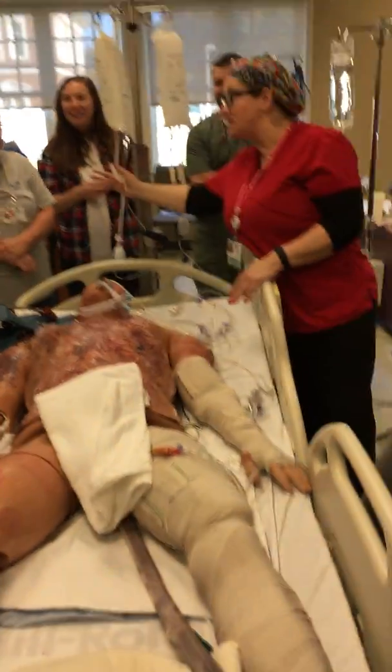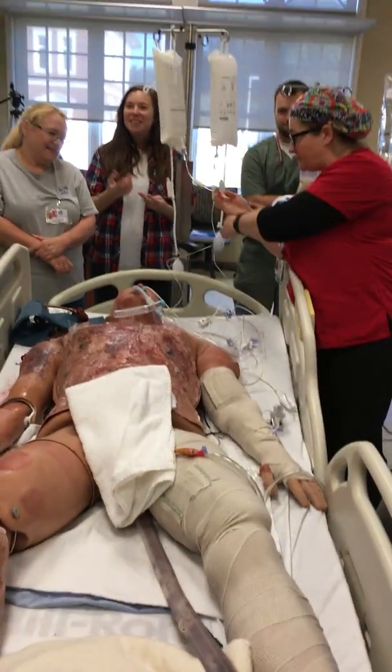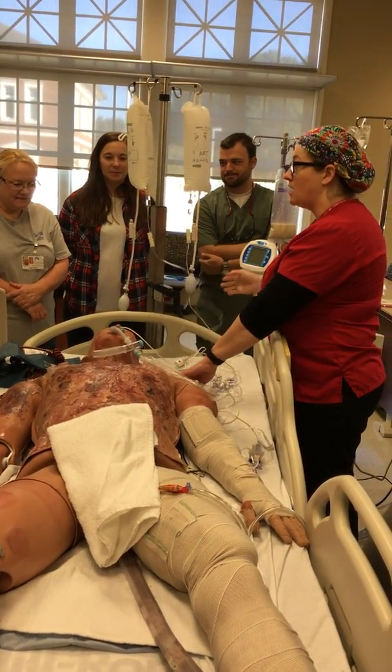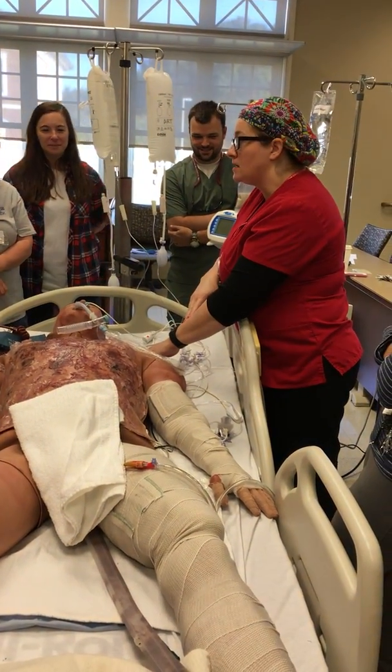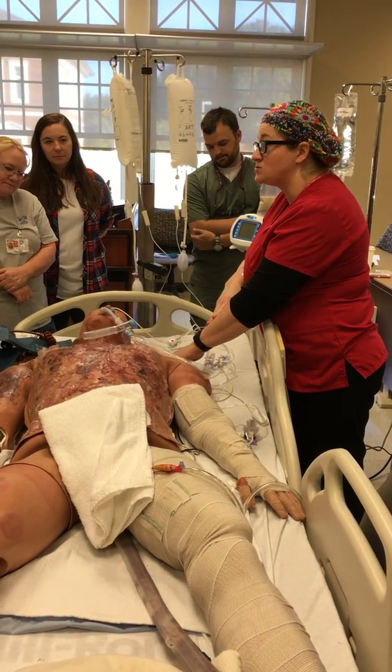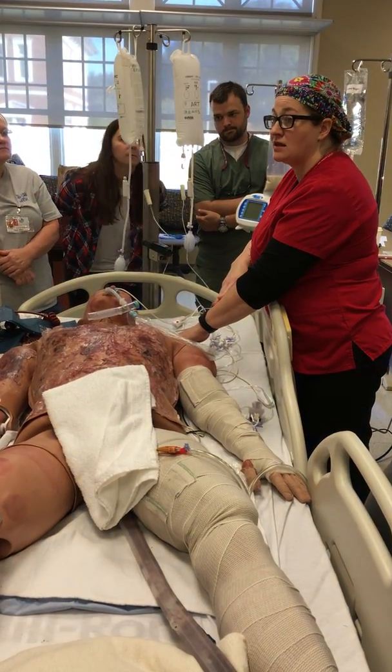Okay, so we monitor a CVP. CVP for us is normally connected to a line here. There's two ways you can monitor a CVP. You can monitor it through a Swan-Ganz, but we don't do Swan-Ganz. We do what we call a LiDCO.